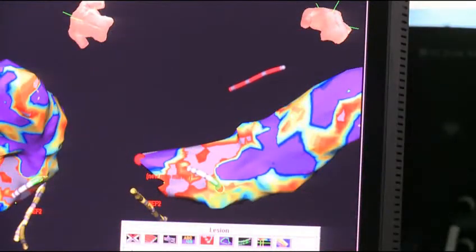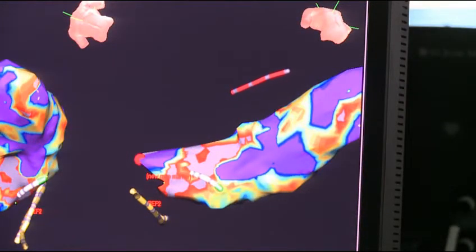Ahora estoy empezando a aplicar radiofrecuencia. En cada punto de aplicación se queda reflejado en la pantalla, en la silueta con un punto marrón.